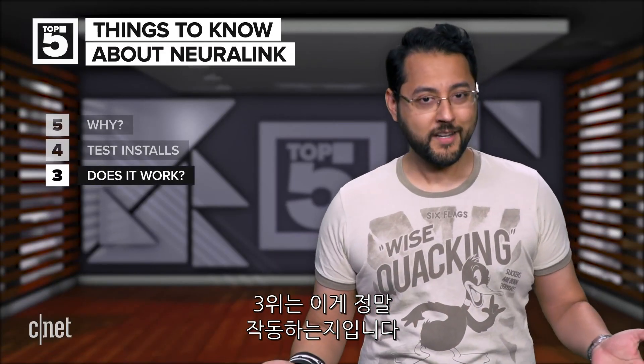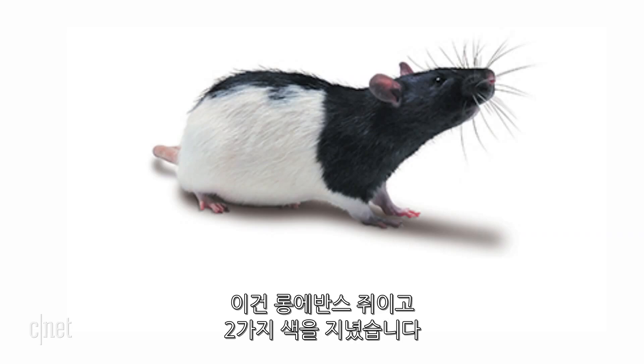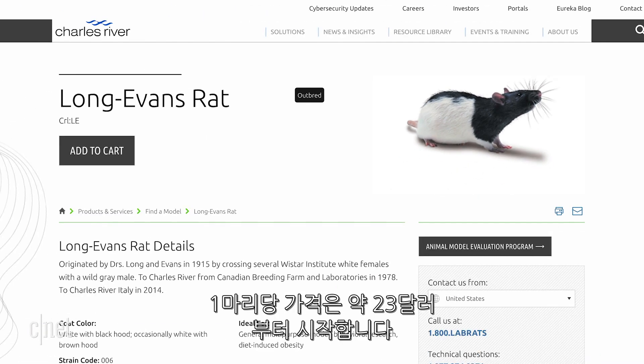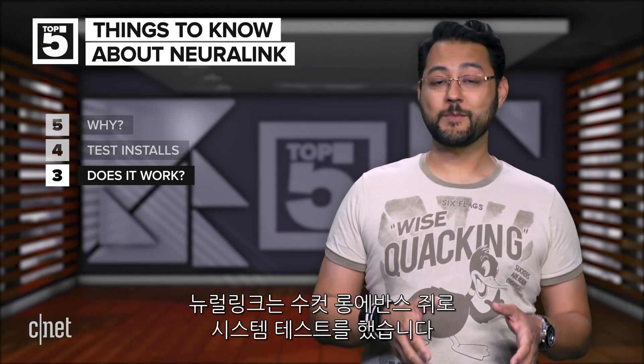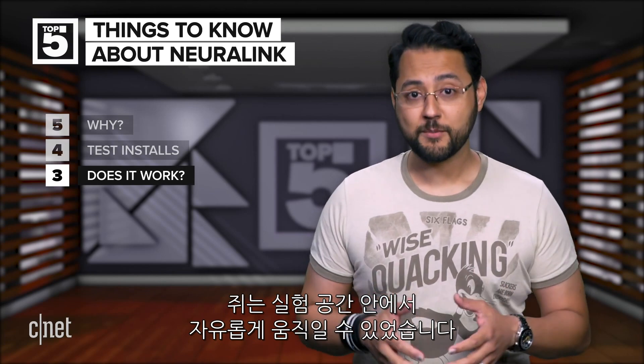Number three: does this thing work? Take a look at this cute little critter — it's called a Long Evans rat. You can buy them for experiments starting at around $23 per rat. So Neuralink tested its systems in male Long Evans rats. Recordings were made as the rats freely explored an arena.